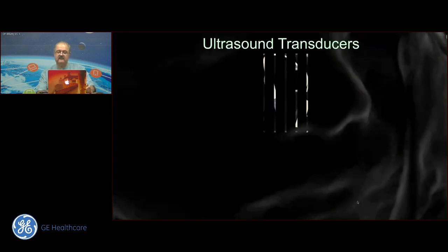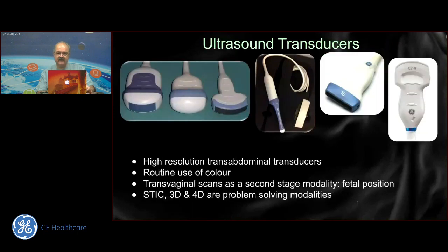Remember that technology is of great use, like in any other part of fetal ultrasound. Once upon a time, life was simple and we used one single transducer like this one, but we've come a long way. This was the first of the useful transducers: with the fetus with the spine anterior, if we use a linear transducer of about 9 megahertz, we were seeing excellent delineation of fetal kidney anatomy. Truly working very well. Then, of course, we came up with 3D transducers, giving us a little more orientation. We don't use those, but I do use my matrix transducer generation 2 to demonstrate a kidney in both planes, which is called the biplanar view.